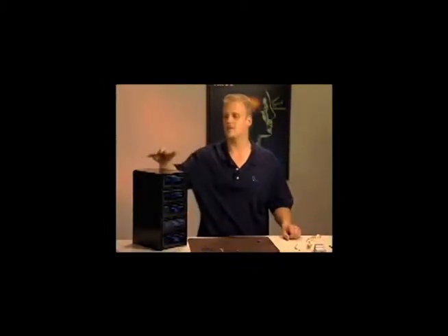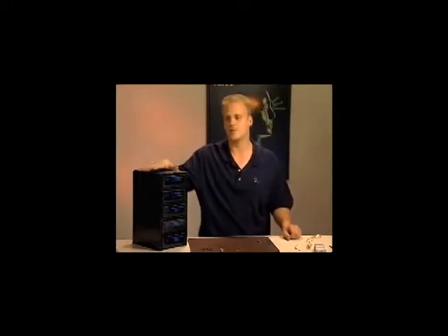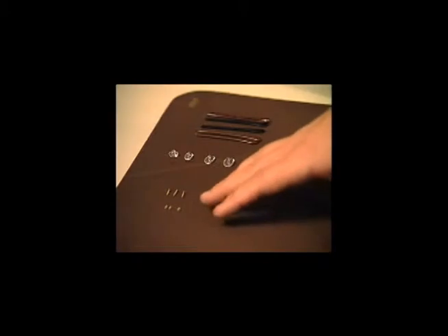Virtually every practice has some sort of system of small parts. For our example here, I'm going to be using the Smart System Pro, which contains all the repair parts that I need for any type of repair work, as far as all the screws and nose pads and temple tips I have a use for. Here laid out on the mat, we have the different types of screws that are contained in this system, and they're both really a good type of screw to have on hand.